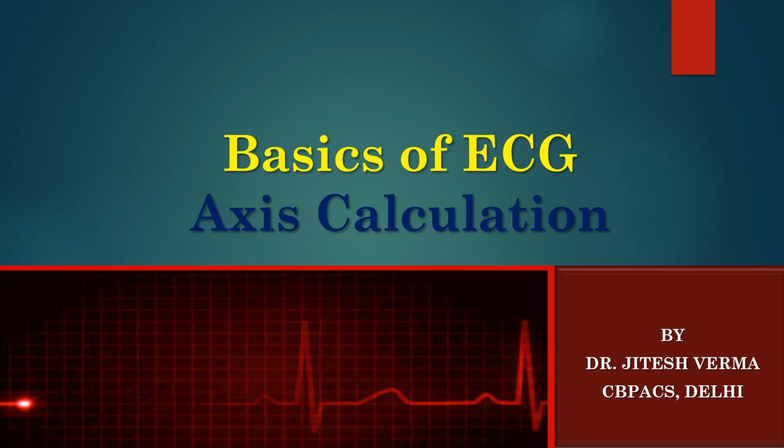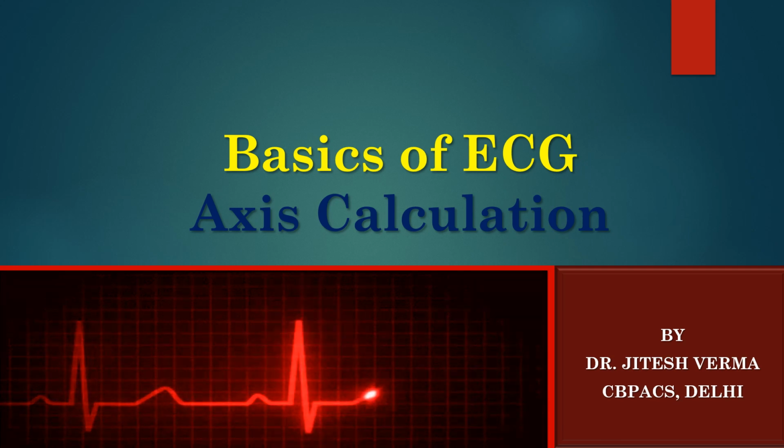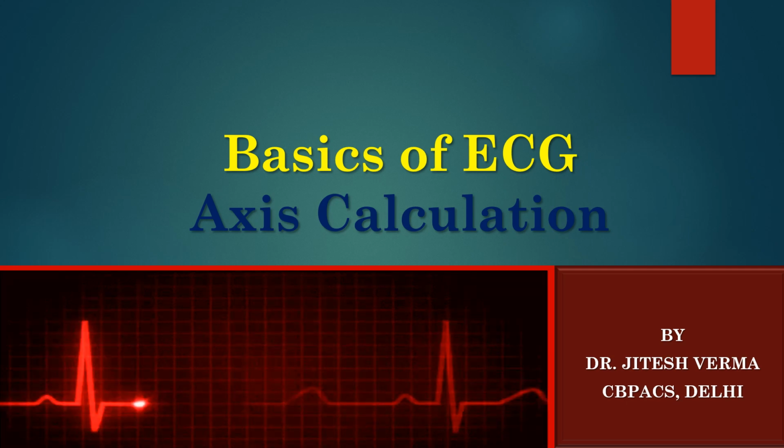Hello dear viewers. In the last class we discussed heart rate calculation from the ECG. Today we will discuss the determination of the cardiac axis, the electrical axis of the heart. Today we will discuss only one method.